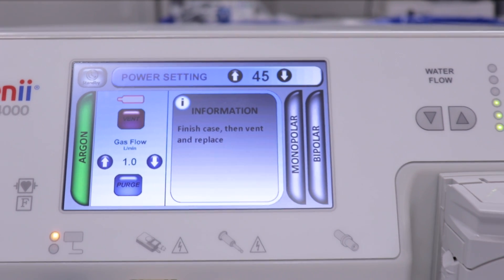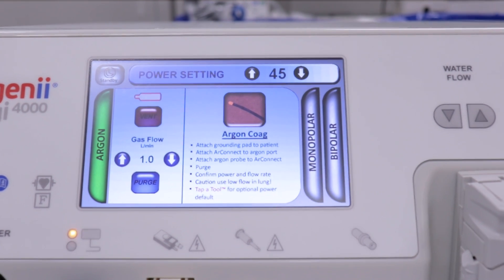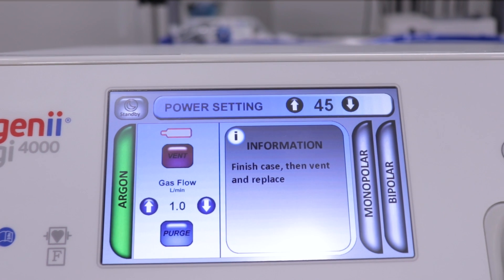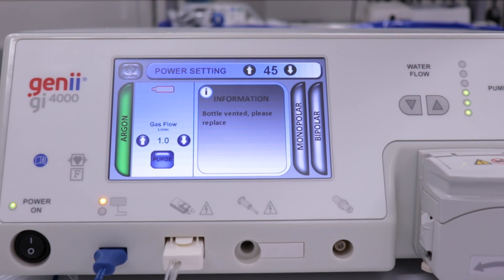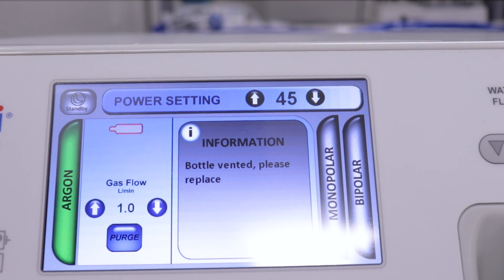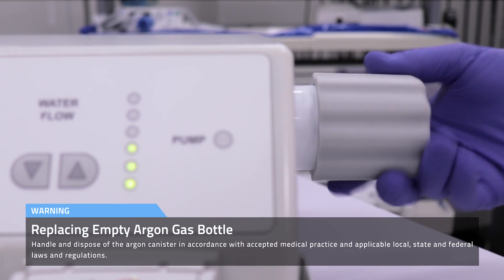As the argon gas bottle is emptied, an on-screen notification will appear, prompting the user to finish the case, then vent and replace the argon gas bottle. The argon bottle icon will change to red and begin flashing. Press the vent button and allow the argon gas bottle to vent until empty. To remove the empty argon gas bottle, turn the bottle counterclockwise until fully unscrewed from the port.